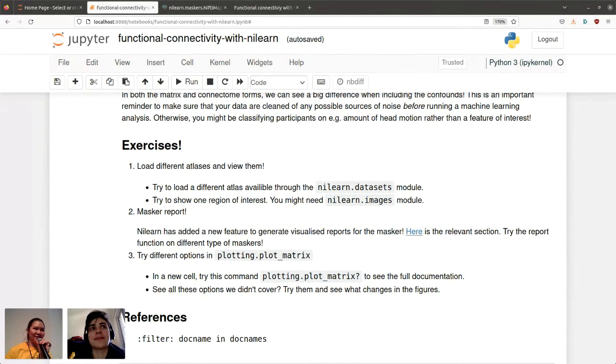I'm going to answer it from a pure fMRI viewpoint rather than a software viewpoint. There are a lot of variables that will introduce noise to our signal, and we call them nuisance variables. Although we have a lot of very complicated preprocessing methods for fMRI data, there will still be some residual signals, and we will need to deal with them after some minimal preprocessing.